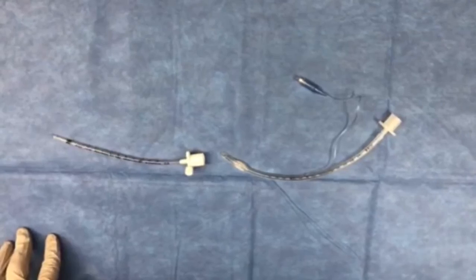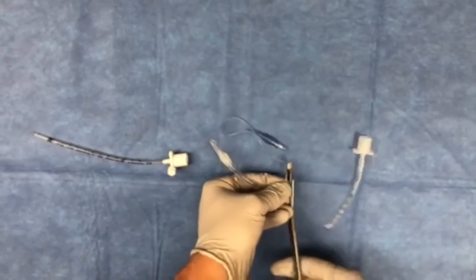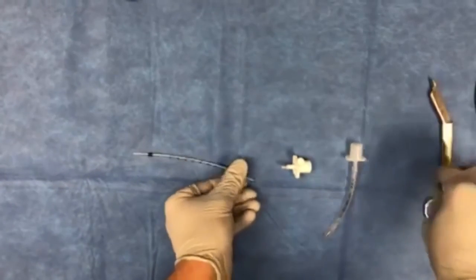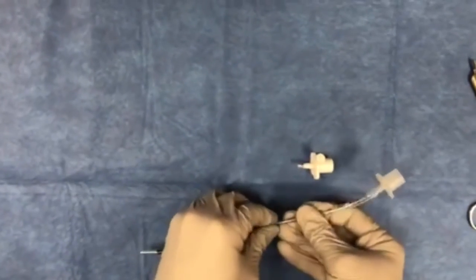When evaluating older patients that have airway obstruction and concerns for either subglottic or tracheal stenosis, a modified endotracheal tube is going to be necessary to have on hand. This is an important concept because endotracheal tubes that are narrow in diameter are typically shorter in length. Therefore, a modified endotracheal tube needs to be created to be narrow yet long. The video shows how to create one to have on the back table in case it is necessary during evaluation.